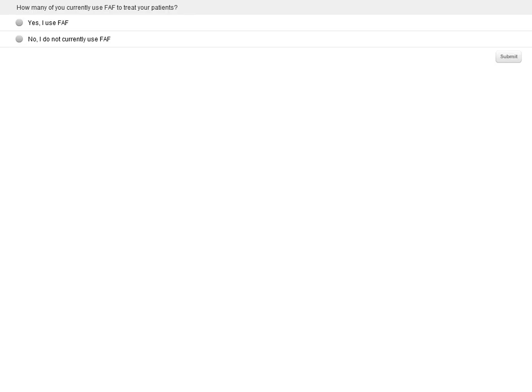As an overview, well, let's ask this question. How many of you currently use FAF to treat your patients, or if not treat, to diagnose your patients? And let's everybody get an answer. And we'll submit the answer. And are we going to get an answer here of what the submissions are? I guess we'll find out in a moment.